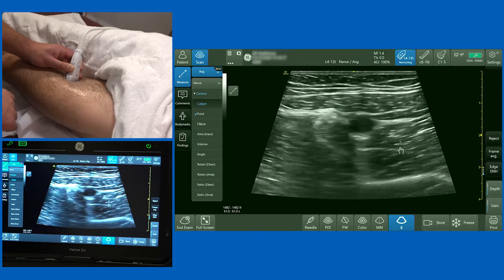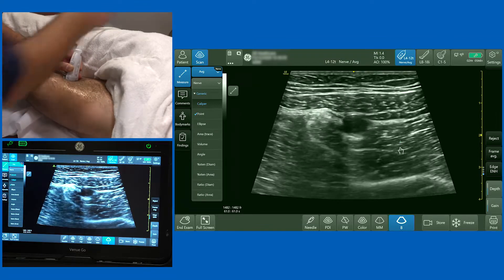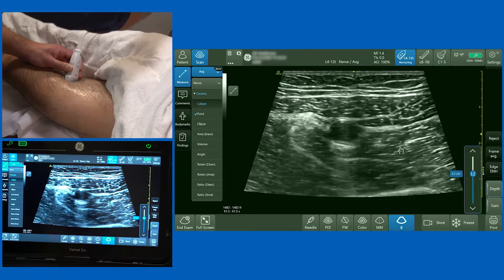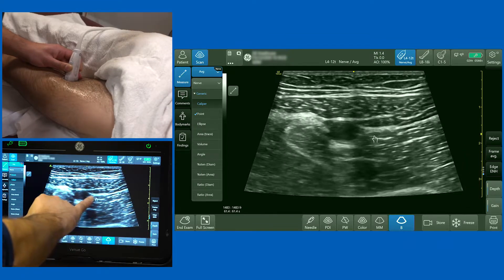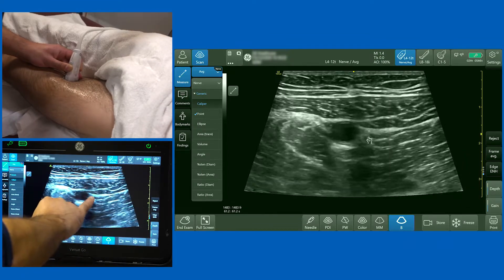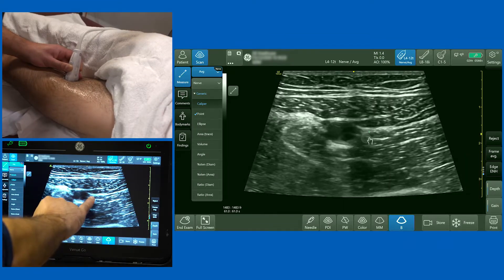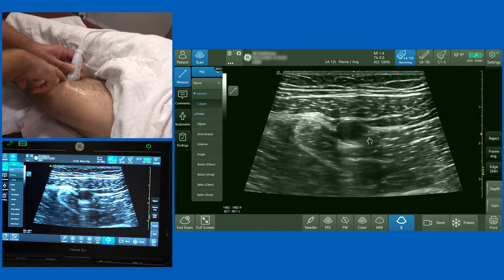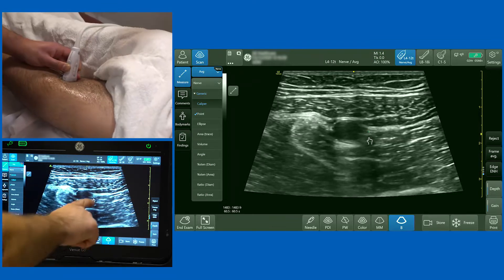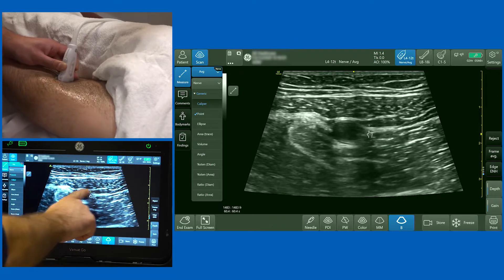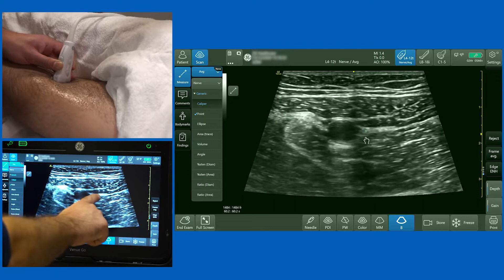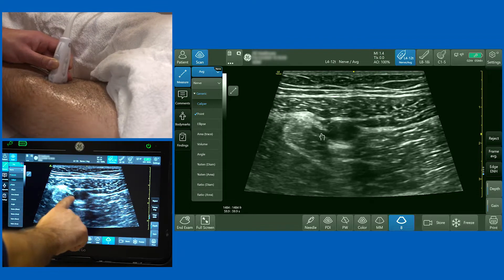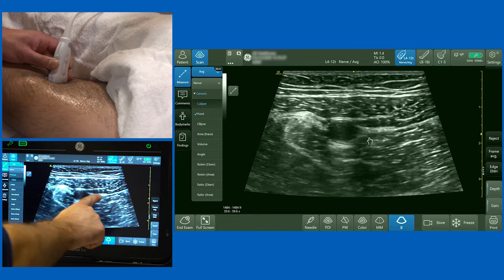If I focus in on that superficial femoral artery, I'm going to drop the depth a little bit and draw your attention to some bright white hyperechoic tissue over here. The aim of this block is to bring local anaesthetic from lateral to medial, be underneath that roof of sartorius, and inject local anaesthetic into this area, surrounding this artery with local anaesthetic.